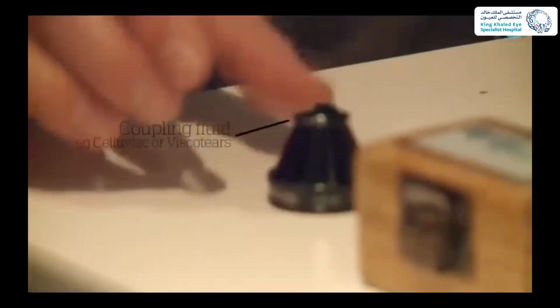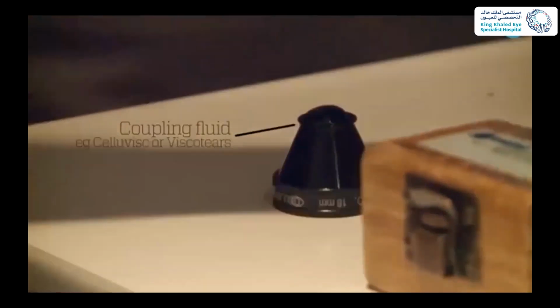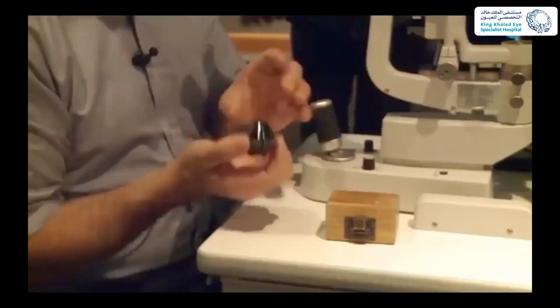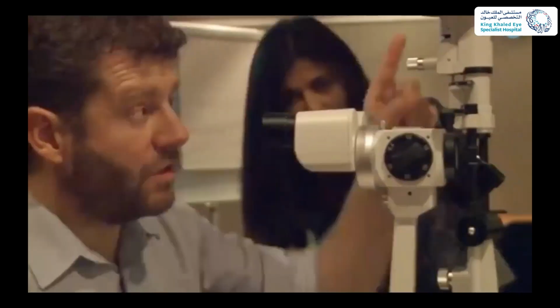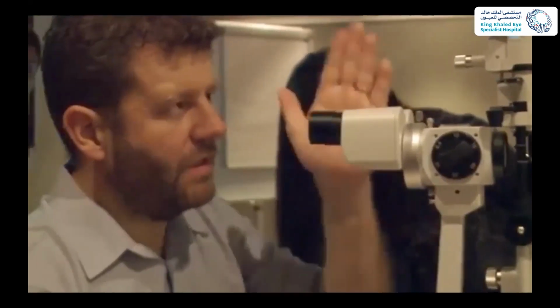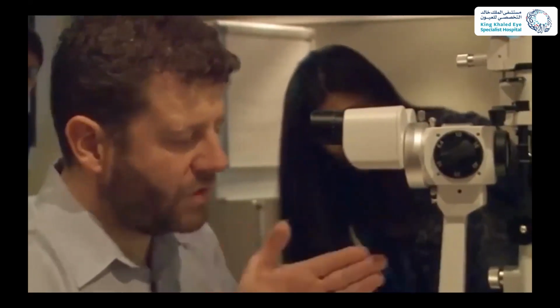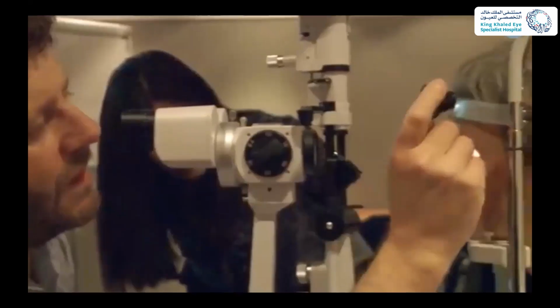So taking the gonioscope with lots of whatever coupling fluid you're using, it wants to be something that stays there if you turn the lens upside down. If it's too liquid, it will just drop off and it'll make life awkward. The lamp housing for the top and bottom angles is angulated off to one side with a vertical beam. And if you don't do that, you will not be looking at the light from the side. You'll be looking at it from straight on.